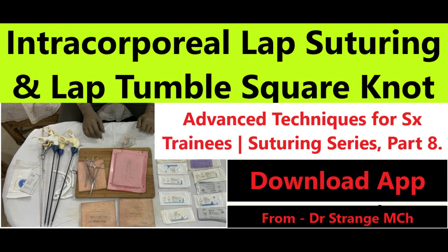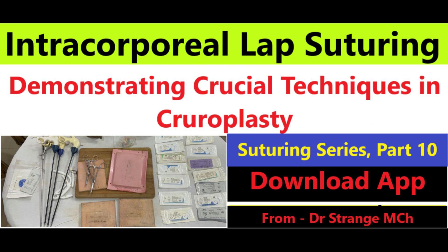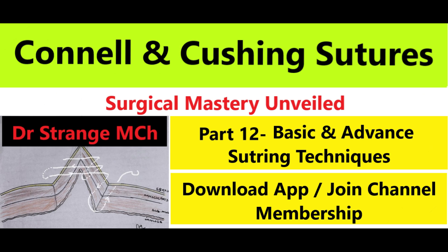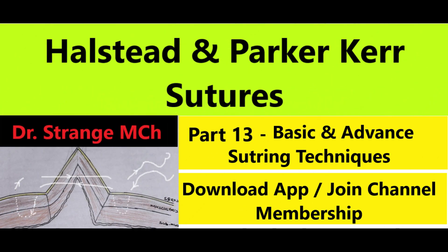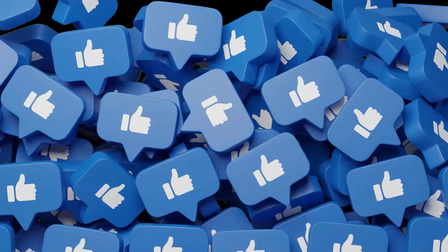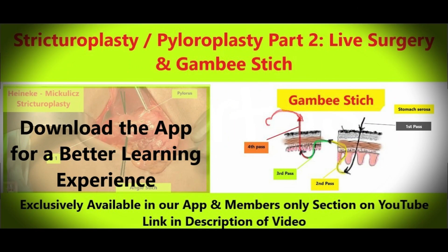I will walk you through each step of the Gambee stitch from needle placement to knot tying. You will learn the ins and outs of this technique and why it is a must-know for any surgical training. By the end of this episode you will be able to perform the Gambee stitch with competence, adding another essential tool to your surgical toolkit.